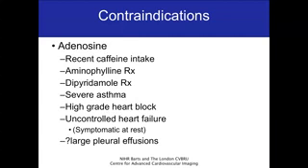Now for adenosine stress perfusion scans, if you've had caffeine intake within the last 12 hours, this can affect the response to adenosine because it counteracts the adenosine response. So the interpretation of your stress perfusion studies will become difficult. It's not really contraindicated, it makes interpretation far more difficult. Similarly, if patients have been on aminophylline or dipyridamole and haven't stopped that treatment.